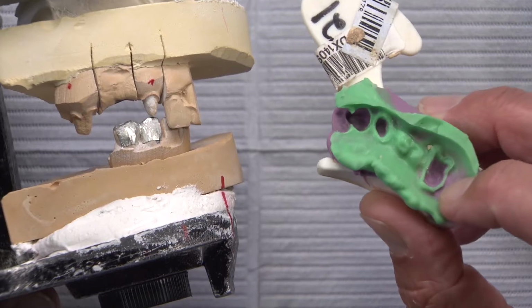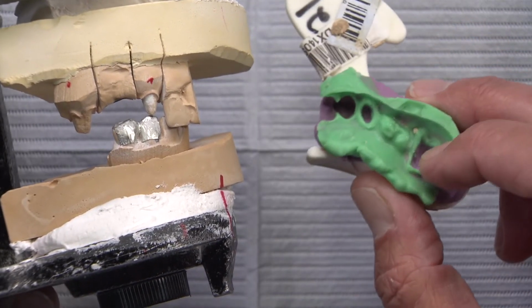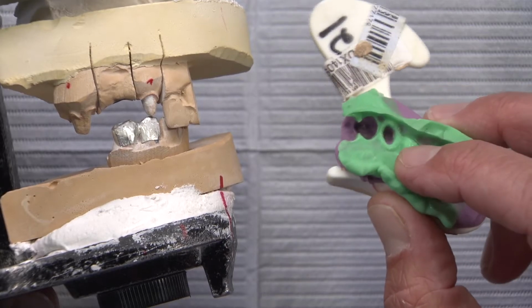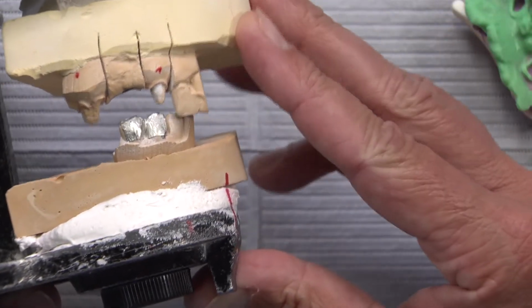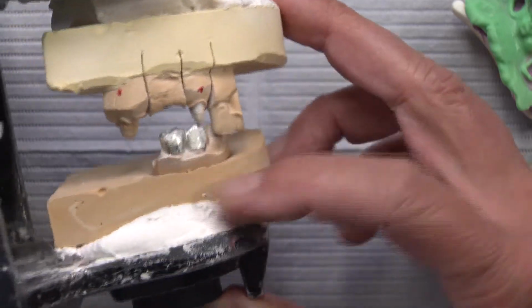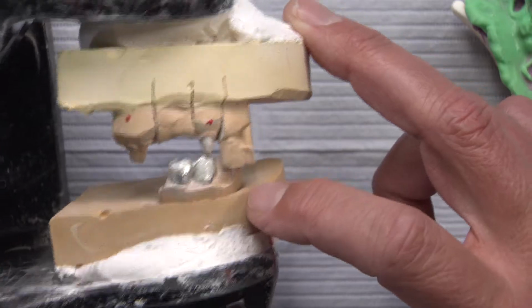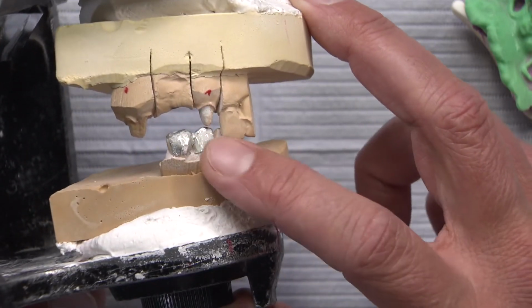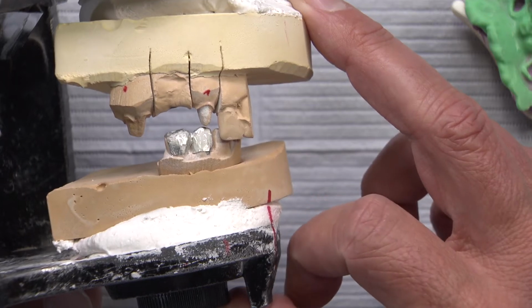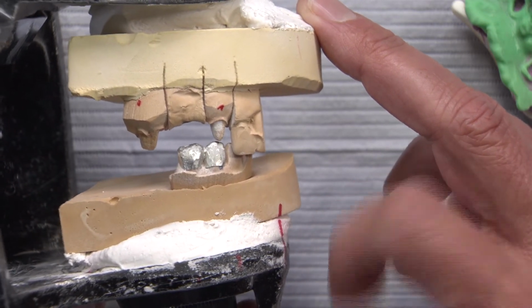You know, if there was one more molar back here, we'd have a 50% chance of getting it correct. But all the posterior teeth have been prepped, and the only thing that's unprepped here is this lateral incisor, and there's just no way we're going to be able to get that right. This is for a PFM bridge, so you can see, whereas now, you know, we've talked about how we design most of our restorations 100 microns out of occlusion to make up for errors in the temporary and to keep you from having to do excessive occlusal adjustment.